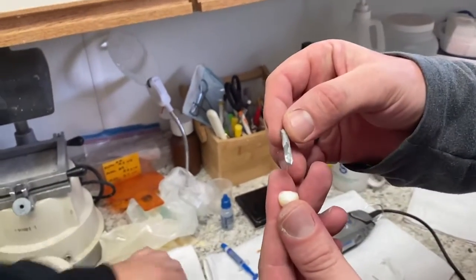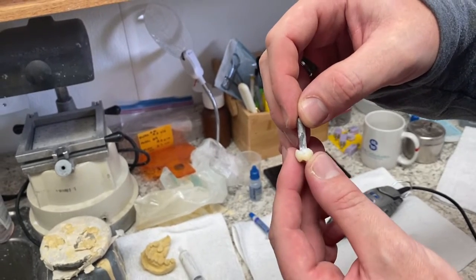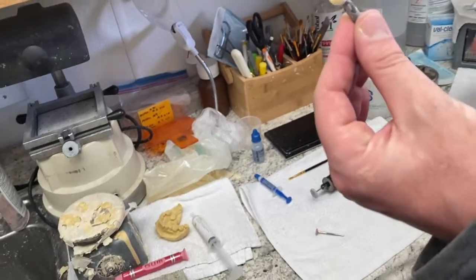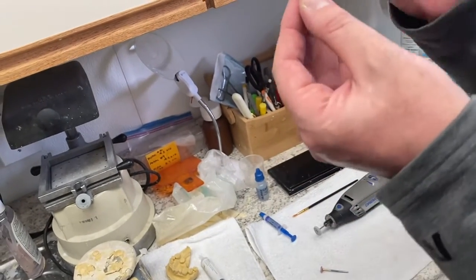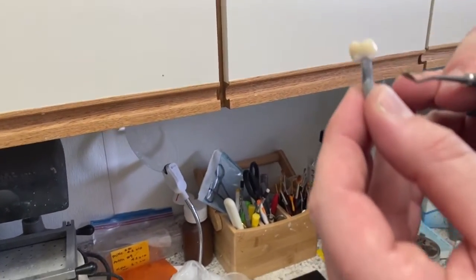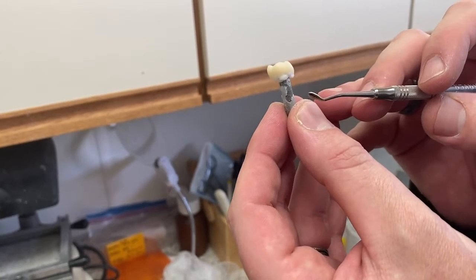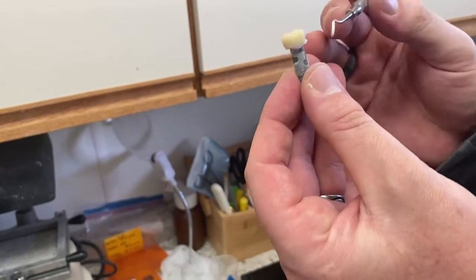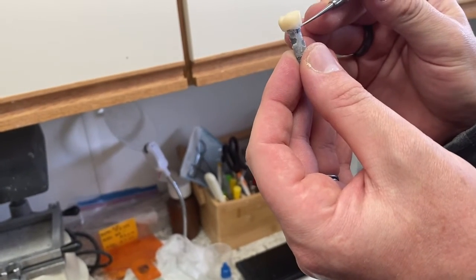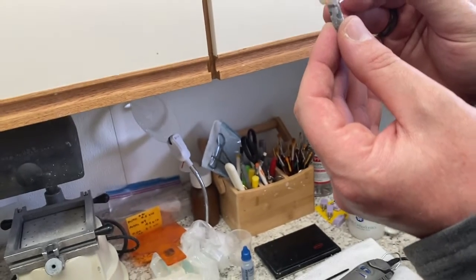So then you take your peg, place it right into that gel. And the one thing you don't want with this is to have a bunch of material sticking out the side here that's going to deposit onto your brush while you're glazing it. Okay. You don't want to contaminate the glaze. This stuff has a lot of particles in it, and it'll stick to your brush.